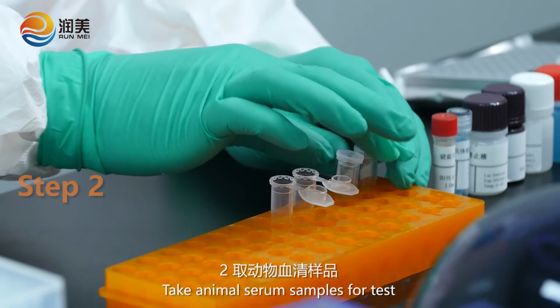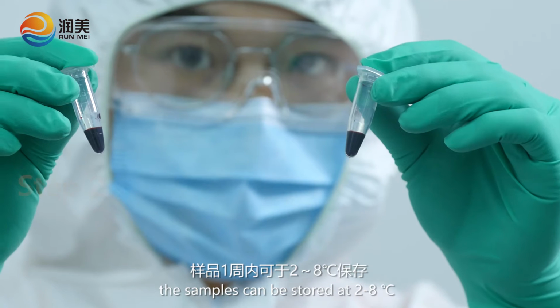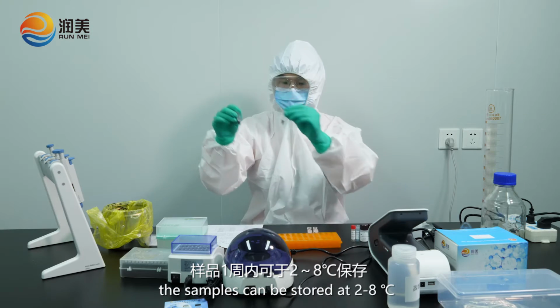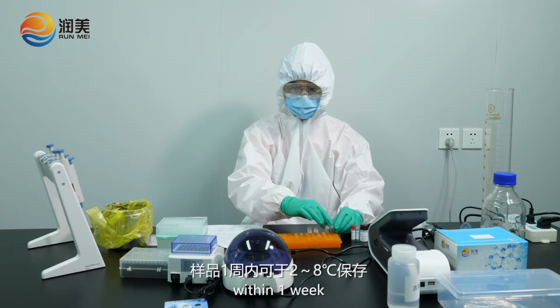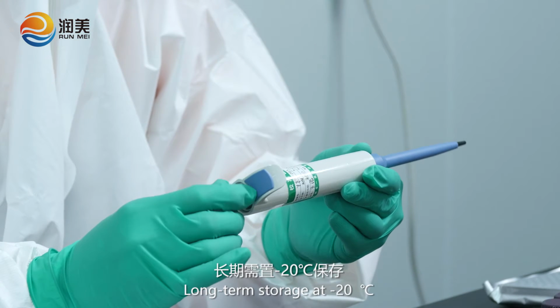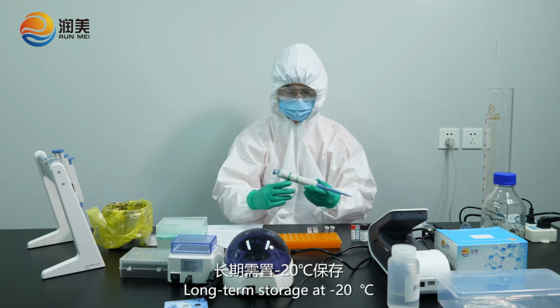Take animal serum samples for test. The samples can be stored at 2 to 8 centigrade within 1 week. Long-term storage at below minus 20 centigrade.